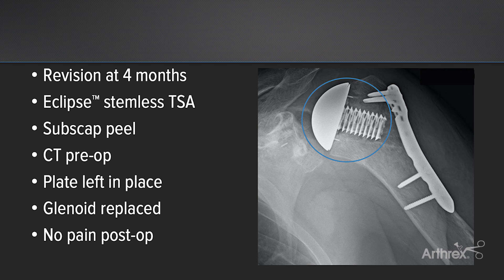This was done in about four months. At that point, we decided to do a resurfacing of the glenoid as well due to the patient's erosions on the CT scan. This specific patient had a deltopectoral incision done previously, so that's what we used to go back in and then identify the plate, and then staying right on the plate, I elevate all the scar tissue right off the plate and try to get a retractor in laterally. We trace back proximal, try to make sure that we're in the right plane between the deltoid, the subacromial space and the rotator cuff, and then carefully elevate the scar tissue off of that.